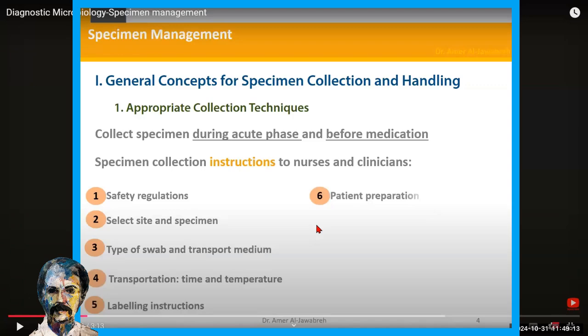But some people also insist on having not only the barcode on the urine cup, the sample, but the barcode plus at least one or two things, maybe the number and the name, two or three things, so that I can just look and I don't have to read it again with the barcode reader. So nowadays we have this and that together on a small piece of paper, and it sticks very hard. So labeling is very important.